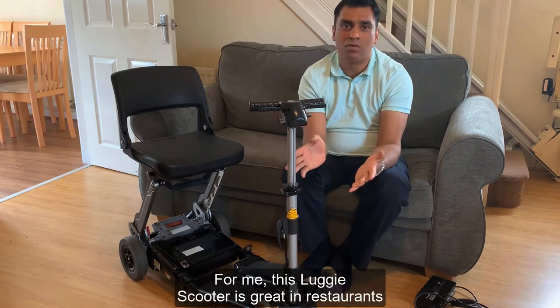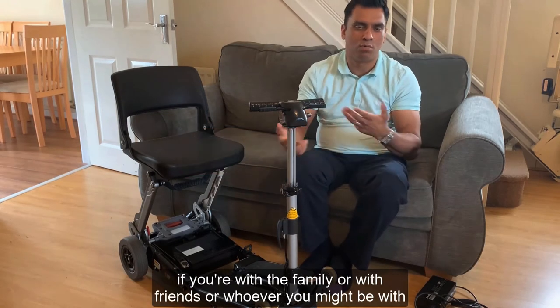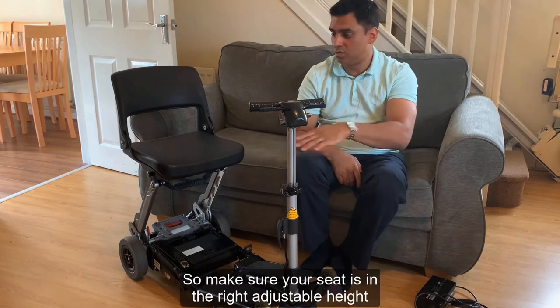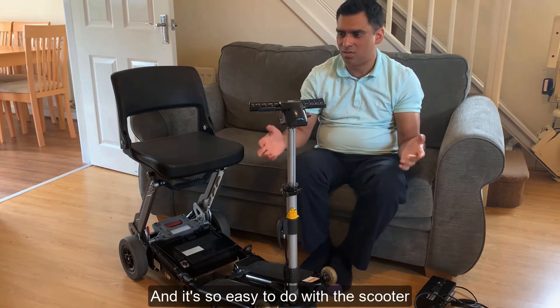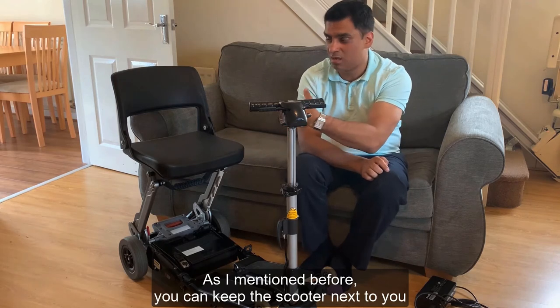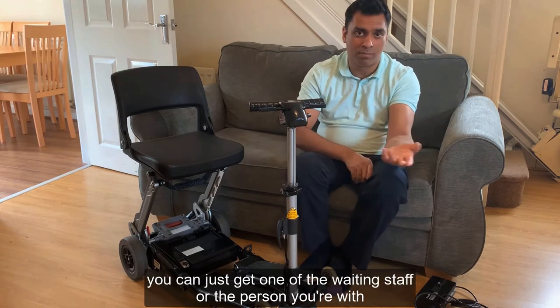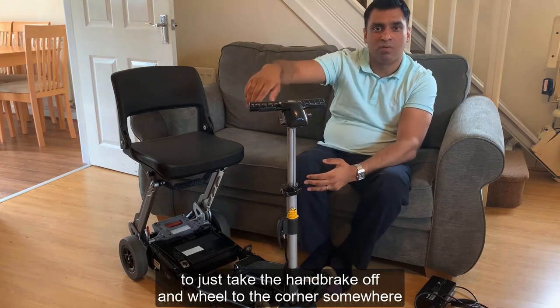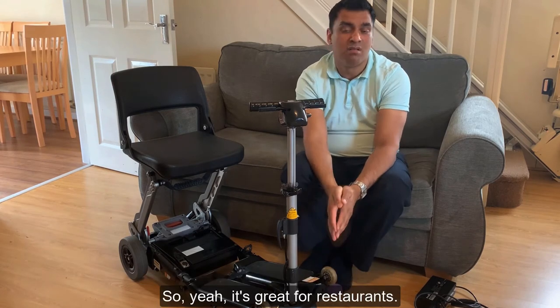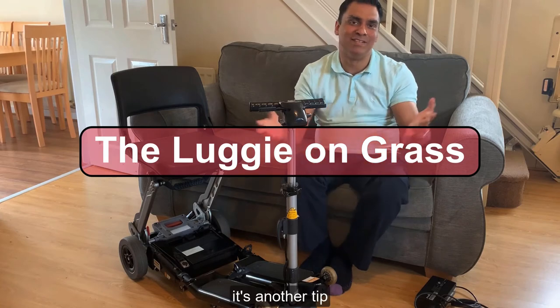The Luggy is great in restaurants. I like to transfer onto a regular chair to enjoy the atmosphere fully. Set the scooter seat to the right height and just slide over - it's really easy. You can keep the scooter next to you, or if it's a fancy restaurant with limited space, ask the waiting staff to take the handbrake off and wheel it to a corner. It very much depends on the restaurant size and layout.